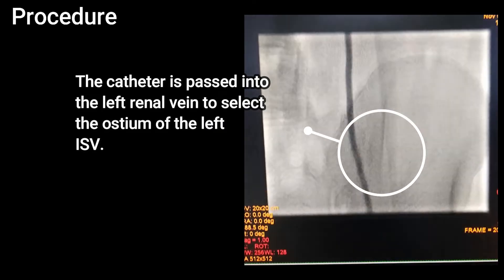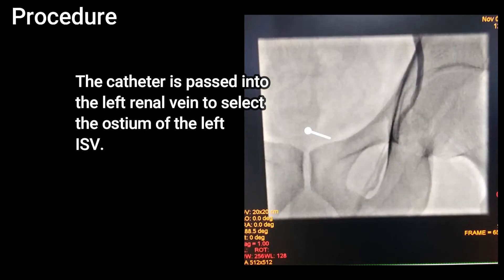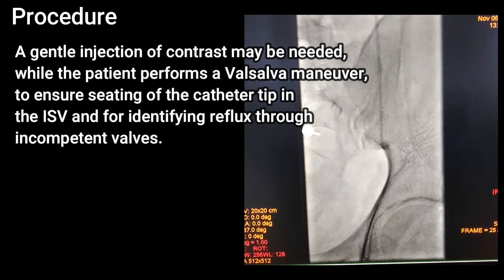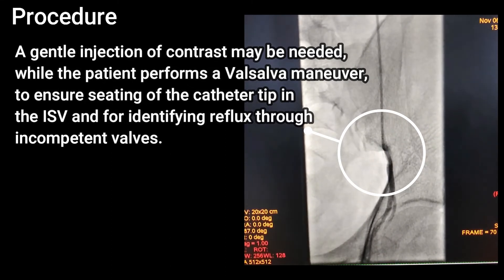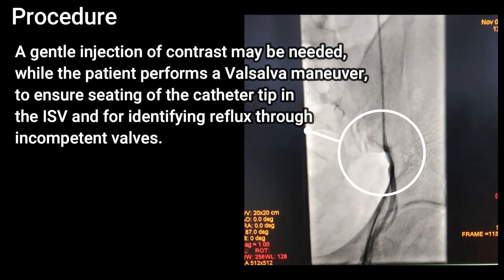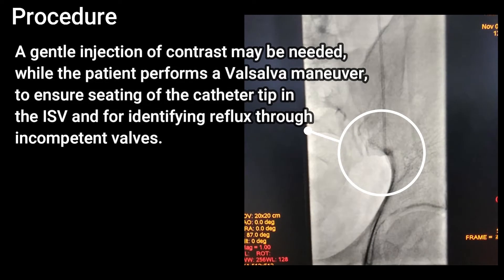In detail, the procedure involves passing the catheter into the left renal vein to select the ostium of the left ISV. A gentle injection of contrast may be needed while the patient performs a Valsalva maneuver to ensure seating of the catheter tip in the ISV and for identifying reflux through incompetent valves.